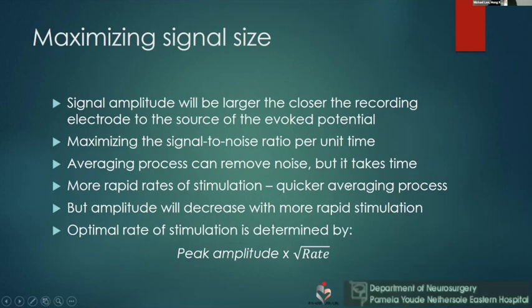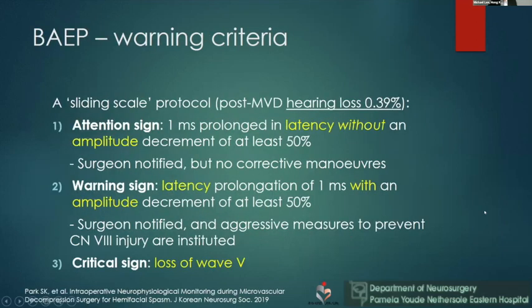But actually life is not so easy. If you have more rapid stimulation, the amplitude will decrease. So actually the optimal rate of stimulation is defined by this equation. So there's a limit to how quick you stimulate, and so this is a problem.